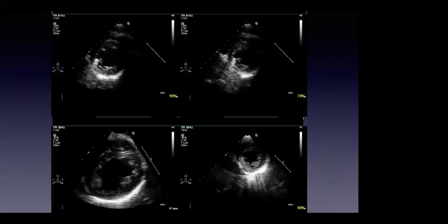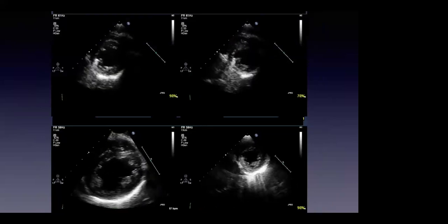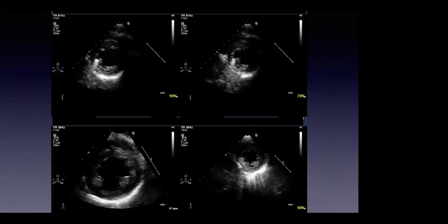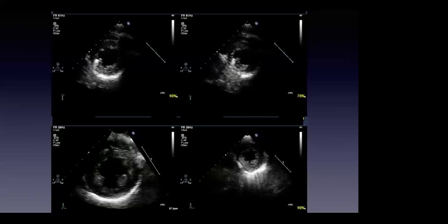All right. This is the pre-images. It's a little bit bright in here, so we can cut the lights in the back. So pre on the top and then post on the bottom. Obviously ventricular function looks a little bit snappier post-operatively. It may have been a couple of days, day one post-op perhaps. Obviously, you don't see the bullet anymore. It's just been removed.